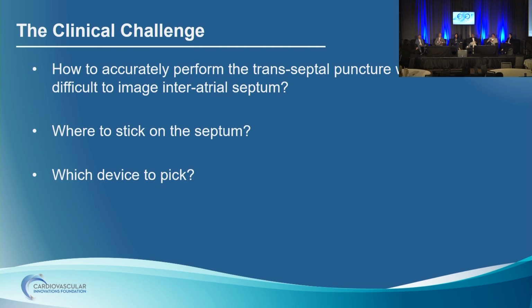So this was done at an outside facility. And I'd like to say also that with these steerable sheaths, we think, oh, well, we could do that with the steerable sheath. But even in a case like this, the steerable sheath will not overcome this. The transeptal puncture is still very, very important for the approach angle. Any other comments?